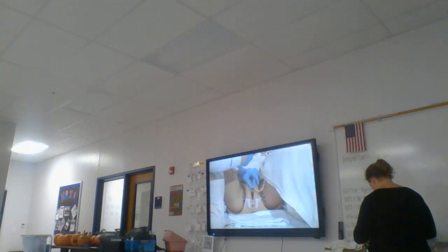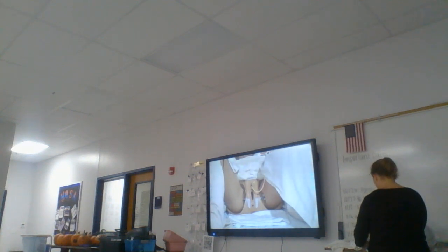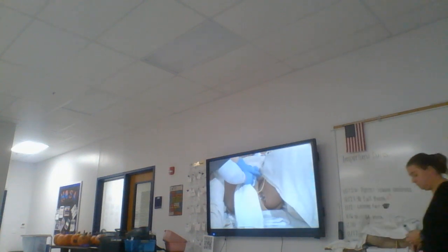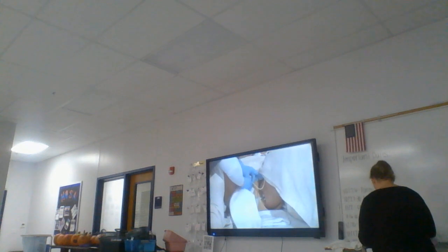While holding the catheter near the meatus without tugging, rinse at least 4 inches of the catheter nearest the meatus. Move in only one direction away from the meatus. Use a clean area of the cloth for each stroke. While holding the catheter near the meatus without tugging, dry at least 4 inches of the catheter nearest the meatus. Move in only one direction away from the meatus.